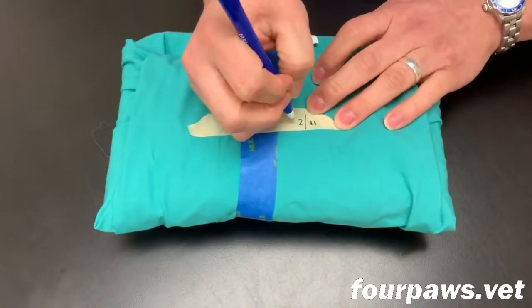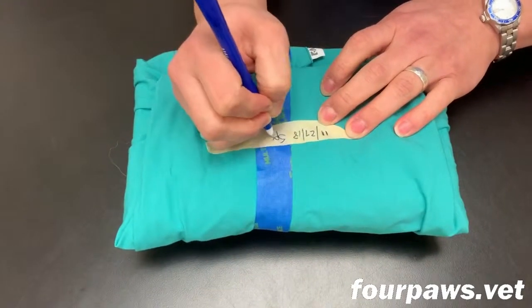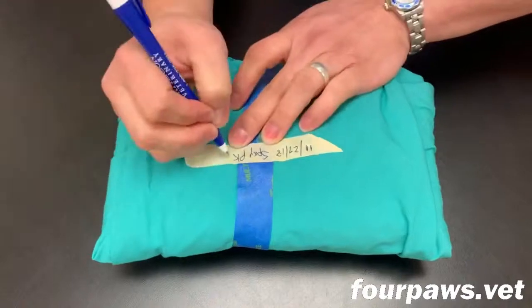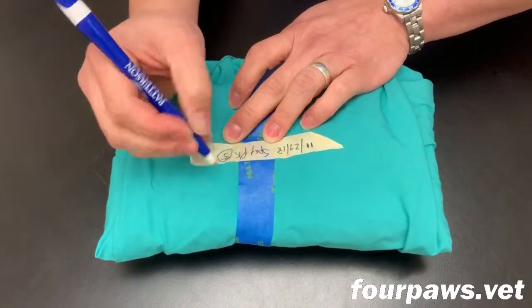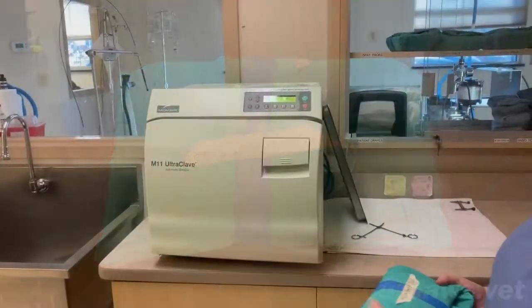The assistant always writes the date that it was prepared, what the pack is as in what kind of instruments it contains, and also their initials in case there are any questions about the contents of the pack.